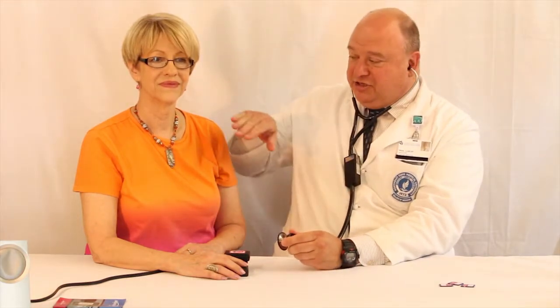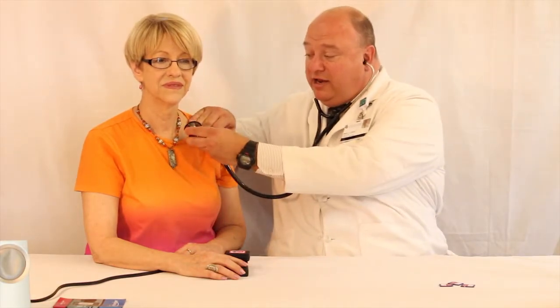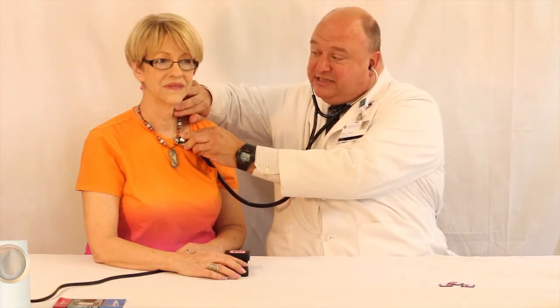Now we can demonstrate a case with a standardized patient operating the ventraloscope. We're going to demonstrate the murmur of aortic insufficiency. I'm going to atypically start on the left side of the chest where this murmur is not, and the patient will press the first button on the A channel. I'm going to check to see that that's in synchrony.